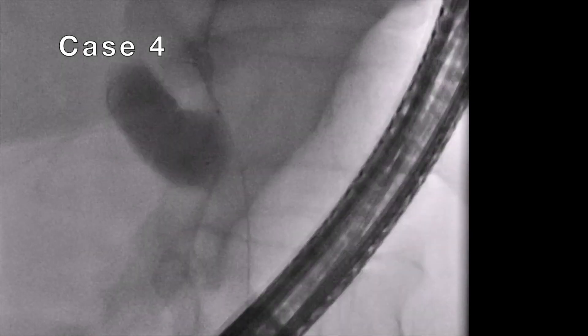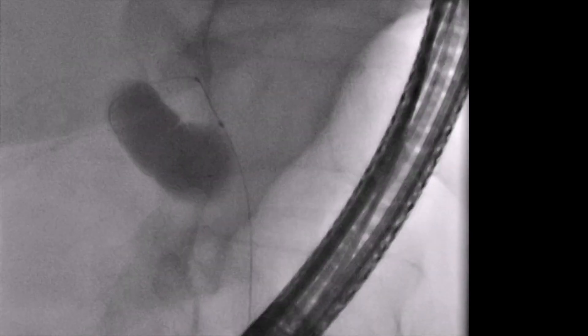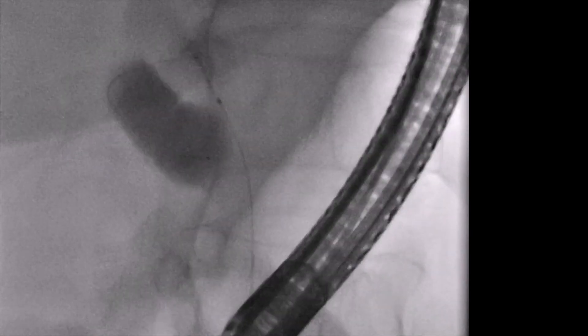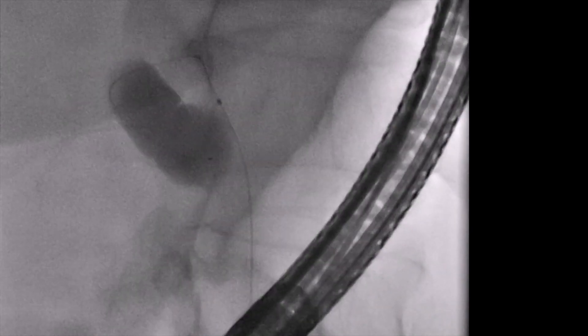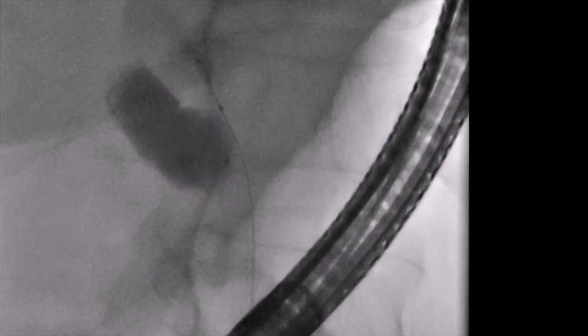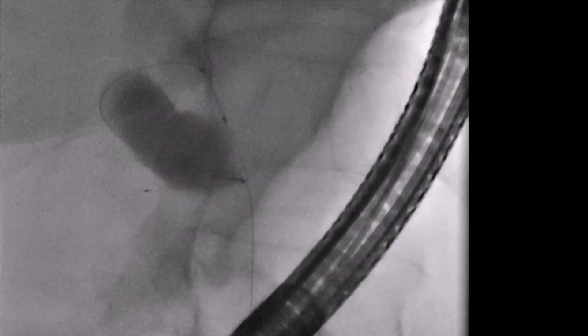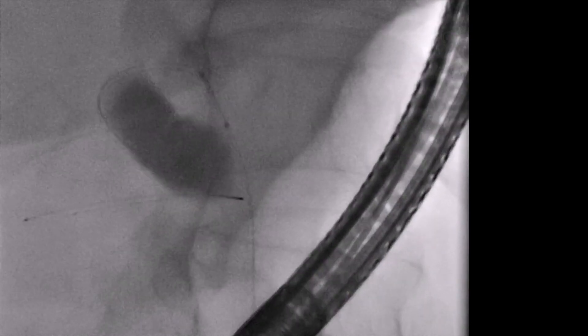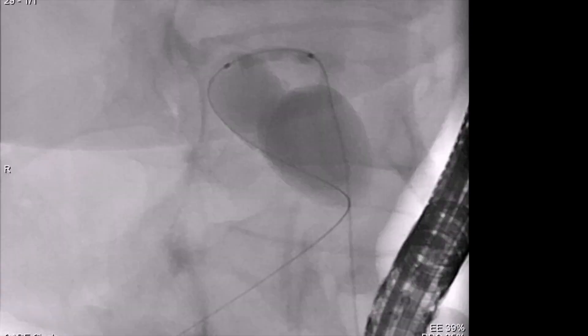After failed cannulation with a 0.035-inch guide wire, this clip shows successful access after downsizing to a 0.018-inch guide wire. In these cases, it can be helpful to utilize a cross-platform, small-caliber angioplasty balloon to dilate the cystic duct and facilitate further intervention.